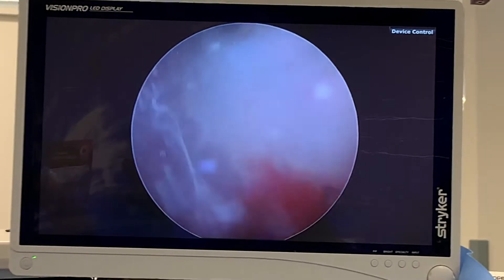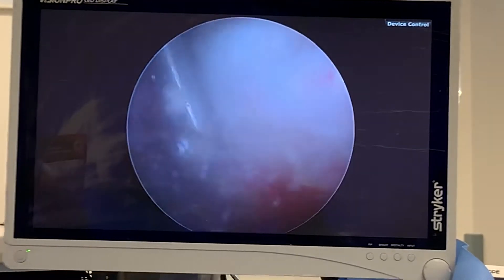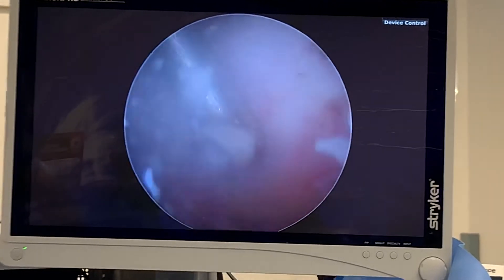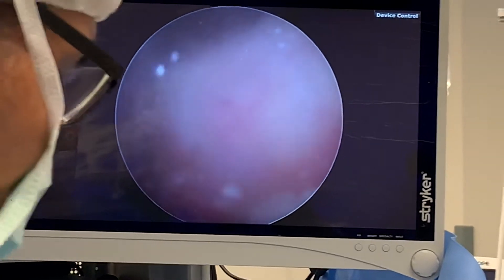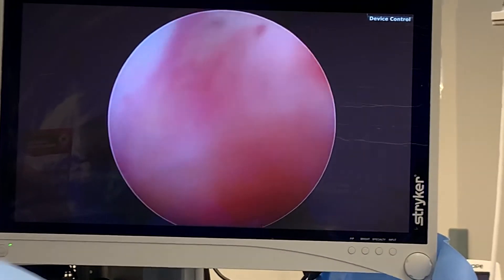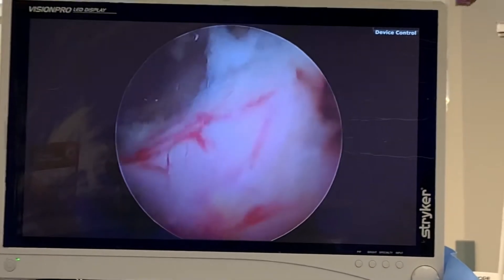Eventually your shoulder calms down and then the calcium gets re-encapsulated. So many times people don't need surgery for calcific tendonitis because it'll cool down on its own. But when it does break apart, that's what it looks like. Let me go ahead and shave this.